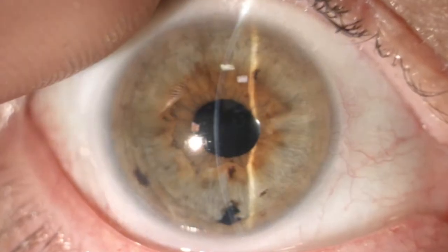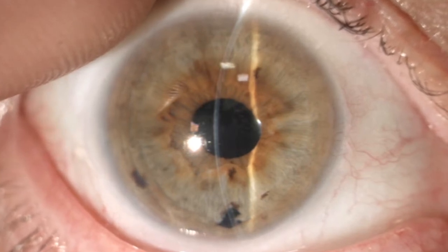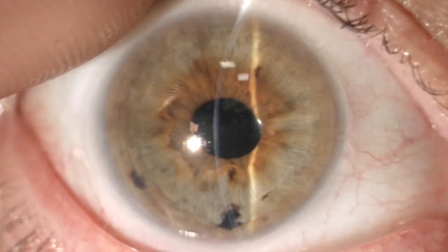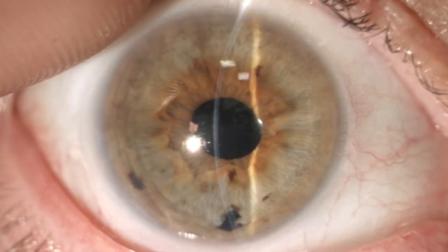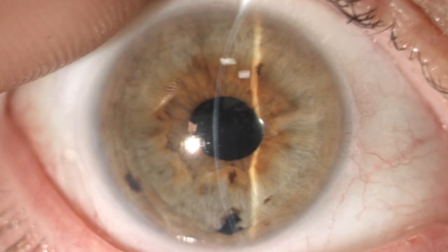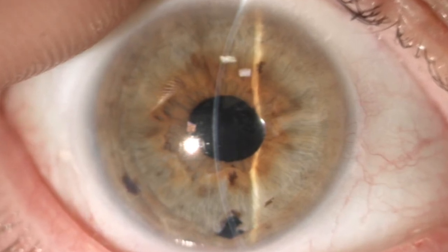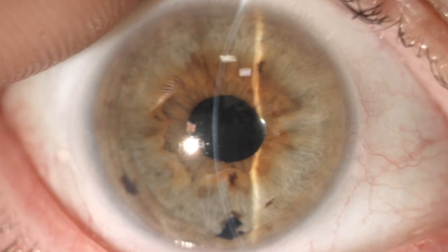Our preliminary results do not show any detrimental effect of preloading onto DMEK donor tissue. Preloading is instrumental in minimizing the surgical time and standardizing the technique, thus contributing substantially to the increasing popularity of DMEK among keratoplasty surgeons.